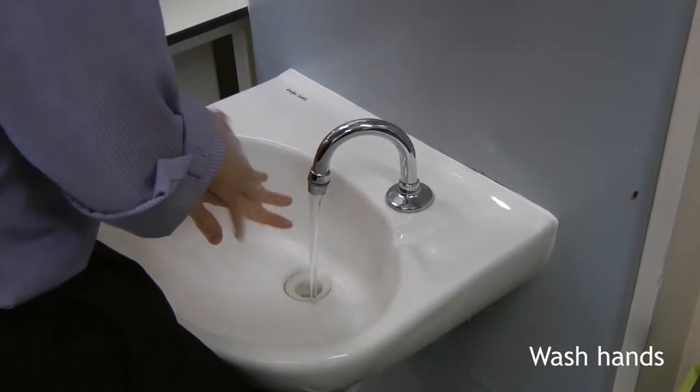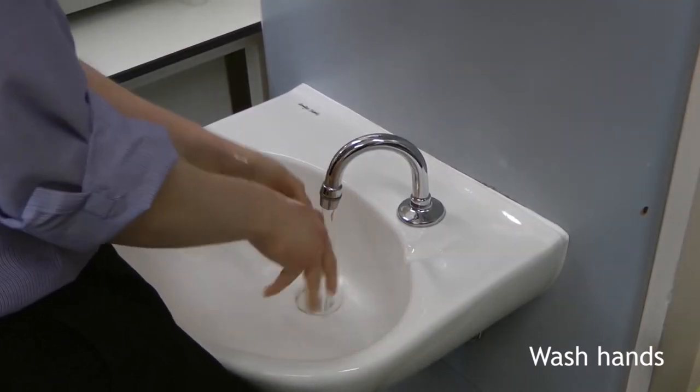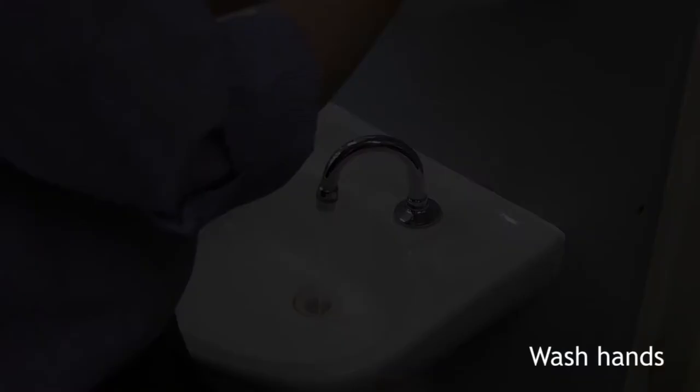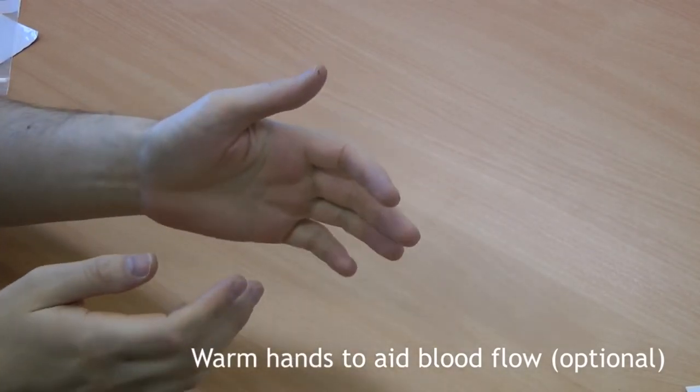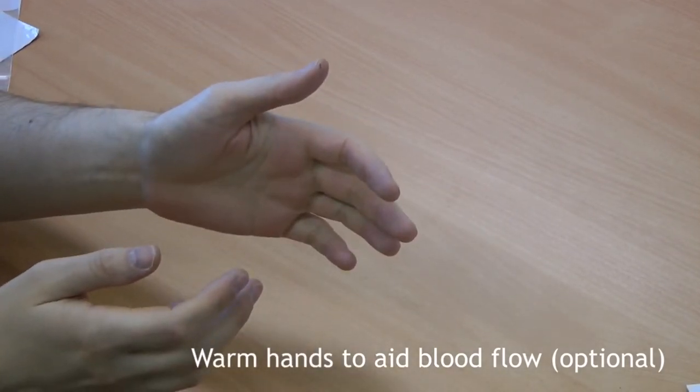Before starting the procedure, you should perform your normal hand hygiene and put on some clean gloves. Ask the patient to wash their hands thoroughly with soap and water and dry them completely using a clean towel. If the patient's hands are cold, ask them to rub their hands together to warm them up. This will help with blood flow.